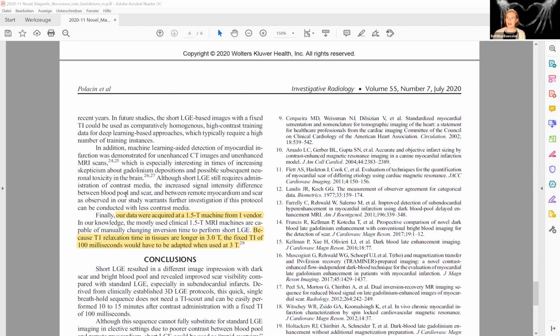So, did you have any cases of microvascular obstruction, and how does MVO look with this short LGE sequence? Yes, actually I have. Now every time something is performed for infarction, we perform the sequence, very nicely, thanks to my technicians also. It's white. I don't have examples right now, but it's white, like remote myocardium. Okay, so the opposite of the normal one. Yes, like with the thrombi. It's not like the thrombi because they are white, obviously, but it's very near to the remote myocardium. It's very bright, very whitish.